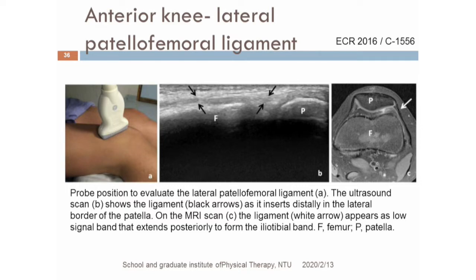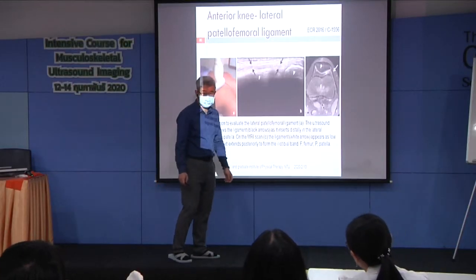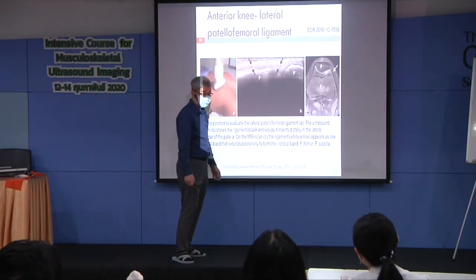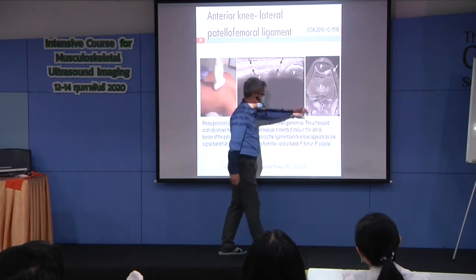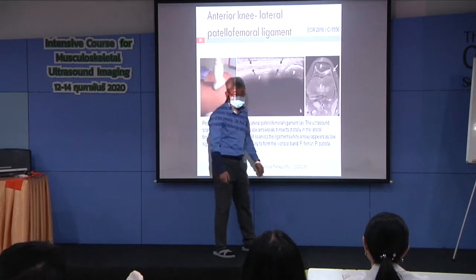Okay, patellofemoral ligament. The patellofemoral ligament is also responsible for transmitting the force from the lateralis and medialis. If the muscles are very weak, in the case of osteoarthritis, they are thickening but hypoechoic, dark.